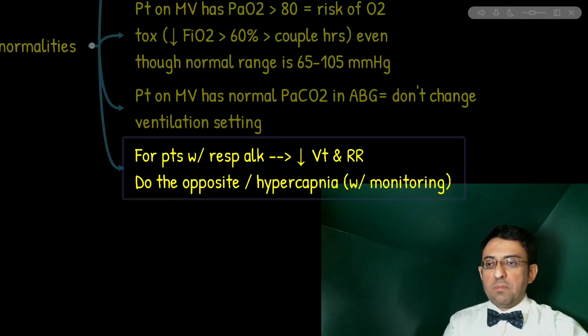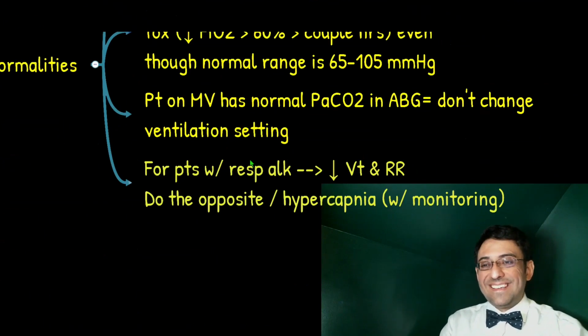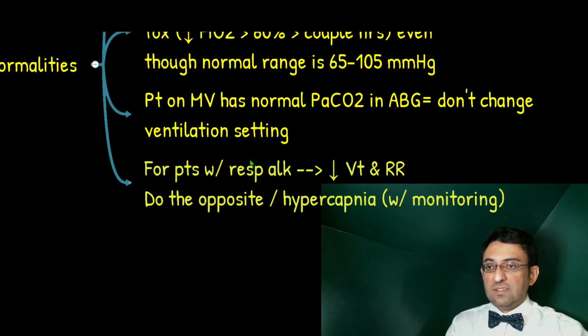By the way, do remember what is the recommended plateau pressure and peak inspiratory flow. The recommended inspiratory flow rate goal is usually 60, that's 60 liters per minute. Maximum recommended peak inspiratory pressure is 35 to 40. We usually want it to be less than 35. And for the plateau pressure, we want it to be less than 30 centimeter water is the unit.